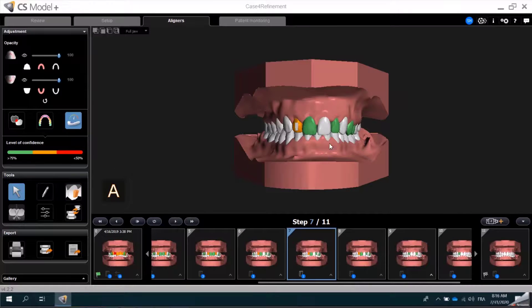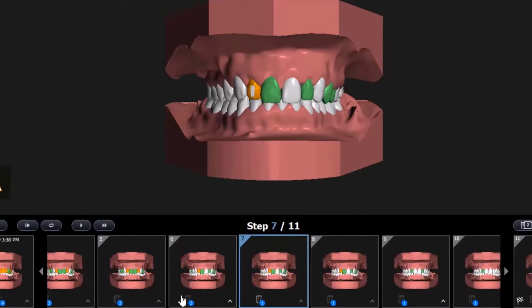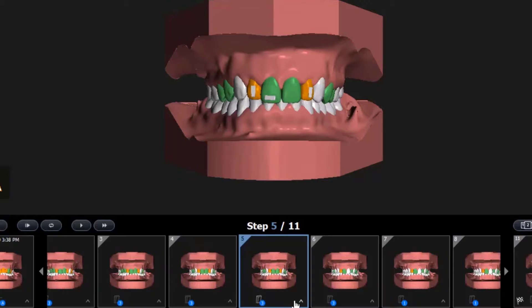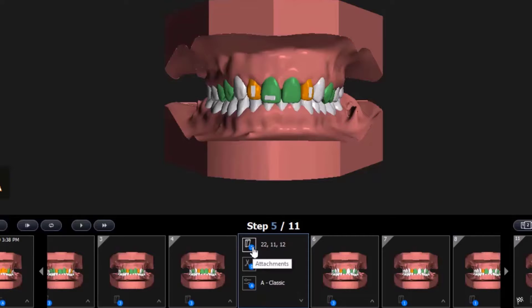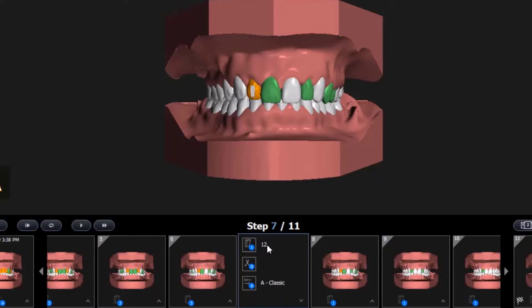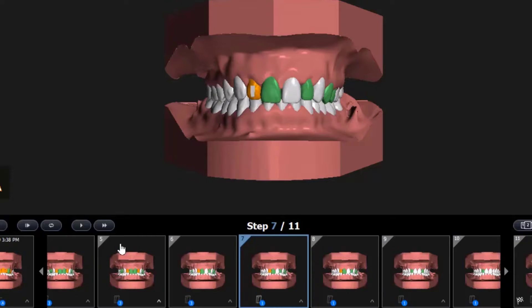Next, I'll click back on the Explore mode, and now you can see that I only have one attachment on Step 7. If I click back on Steps 6 and 5, you can see the attachments are still displayed. You can see on Step 5 that there is an indicator showing there are three attachments. I can view the details and see the tooth numbers for the attachment placement. If I advance to Step 7, I can see there is only one attachment as I have removed the others.